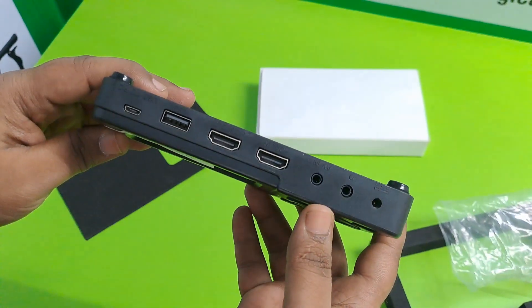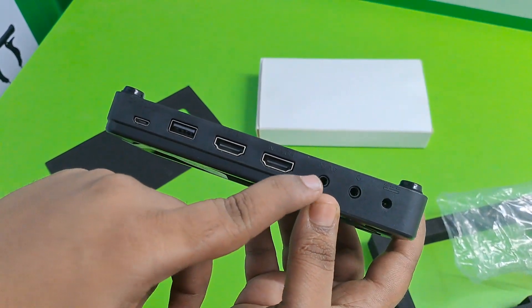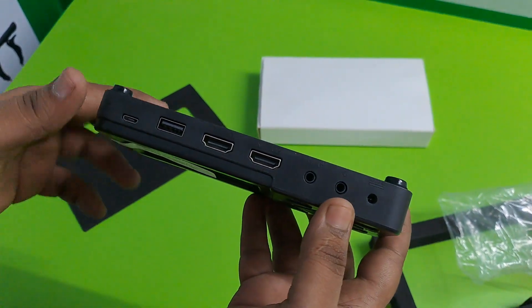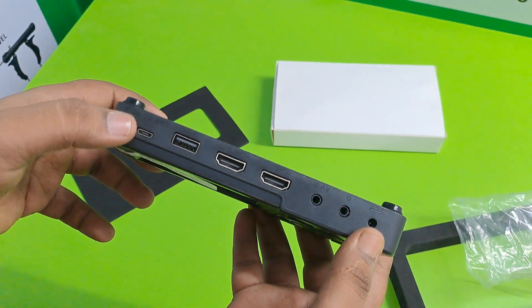There are ports: USB, HDMI ports, AV, mic charger, PC, USB charger.